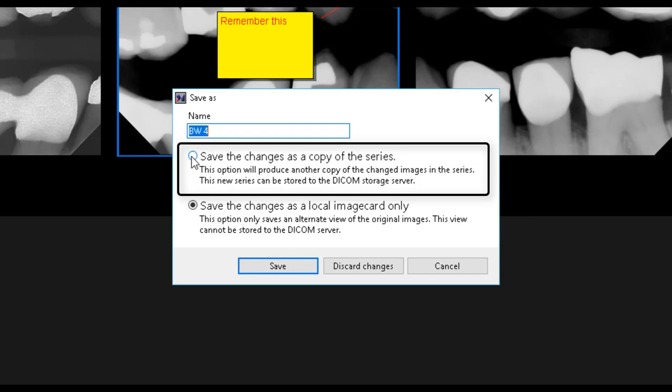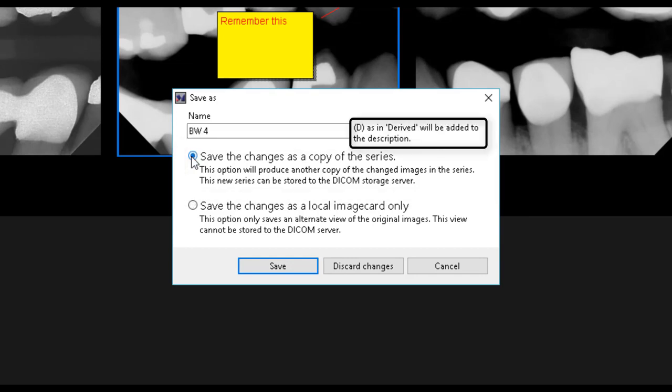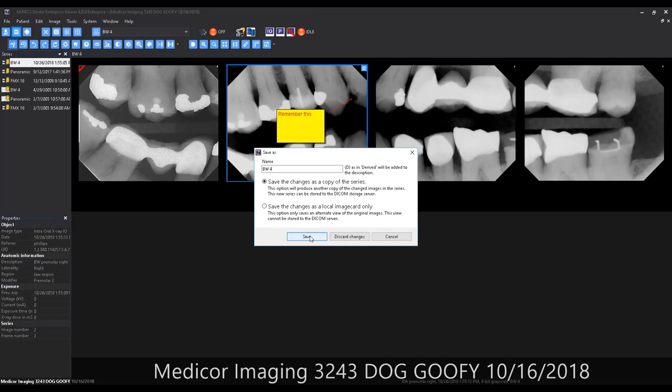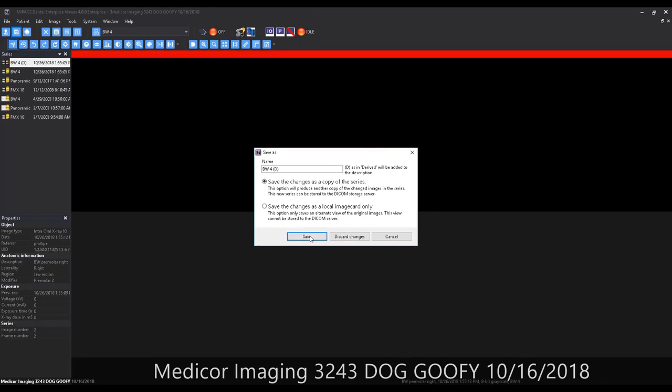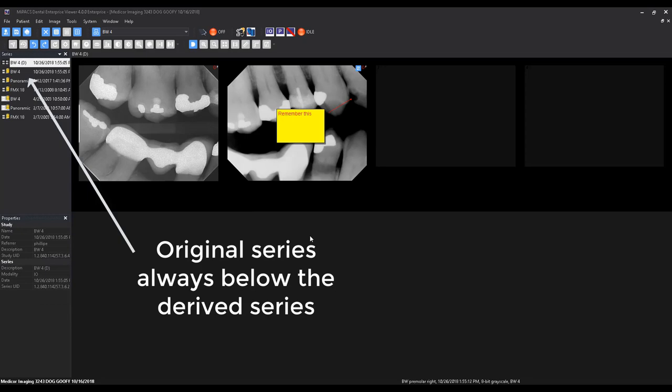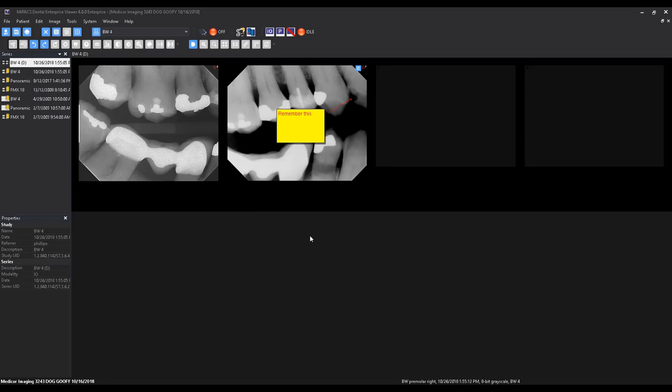Local copies, unlike derived series, cannot be stored to the DICOM server. After a derived series has been saved, it will always appear above the original series in the series view.